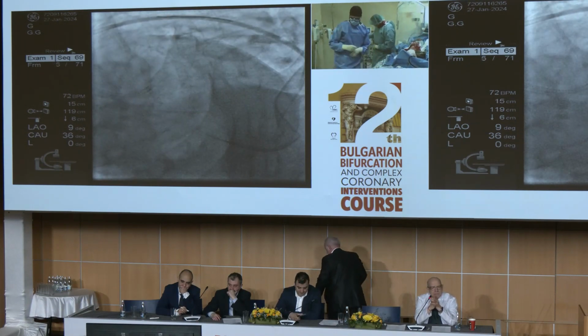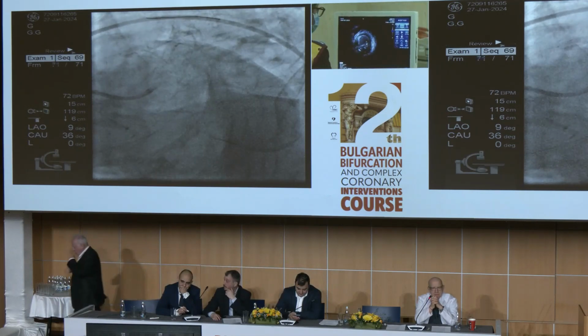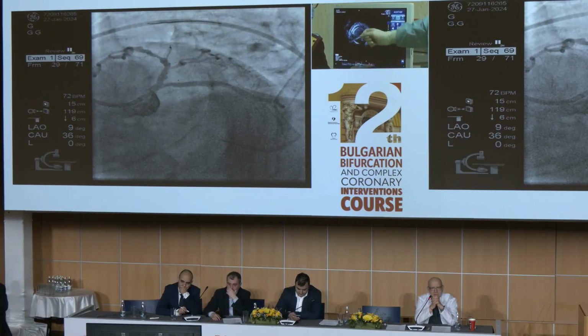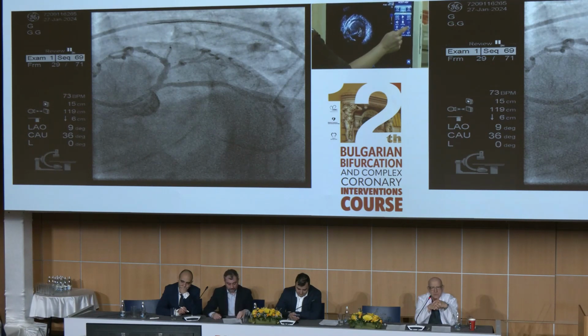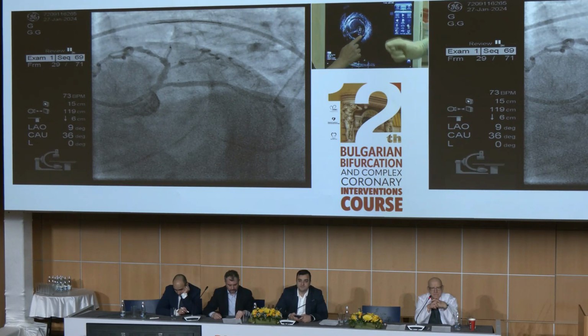What we are thinking here is probably, no, this is the stent. Yes, here. Exactly here, just to see the lumen area, and we'll be sure. The lumen, just measure. Okay. No. Back.